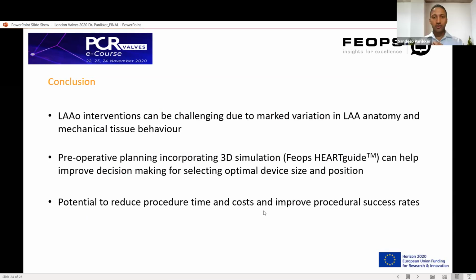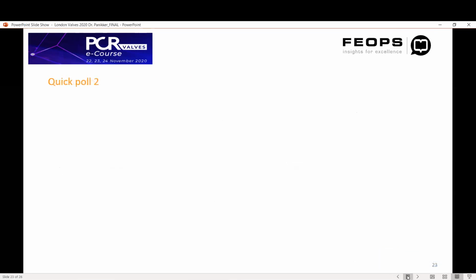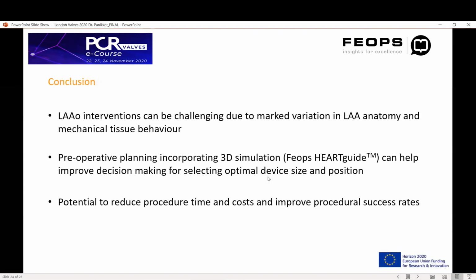I would like, yes, of course, your opinion about that. So one question is about the catheter you are using. Do you use an anterior true seal curve for the last case that you were presenting? So actually, what was interesting, this was one of the first WATCHMAN FLX implants within the UK, and they didn't have the anterior curve because it was stuck in Europe. So I normally would have, but in this position, I actually used the double curve and it was fine.